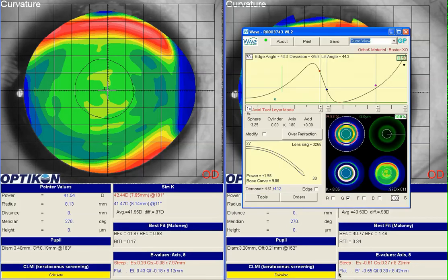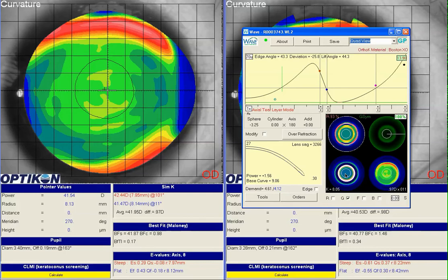Here's the lens that the patient is wearing right now. One thing that catches my attention is the white ring where the reverse curve is, but we also have another light blue ring, which indicates a steepening of the curve on the F2 surface — not really the base curve at that point. I think the lens is curving down and bearing down on the cornea, lifting it away where we need better contact at the back of the reverse curve and at the apex of the cornea. This outer ring is very likely a result of the patient's lid indentation showing on the topography.